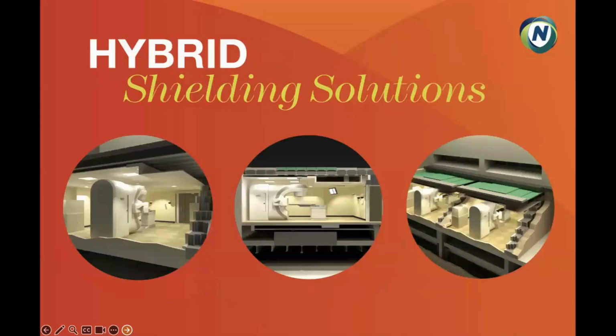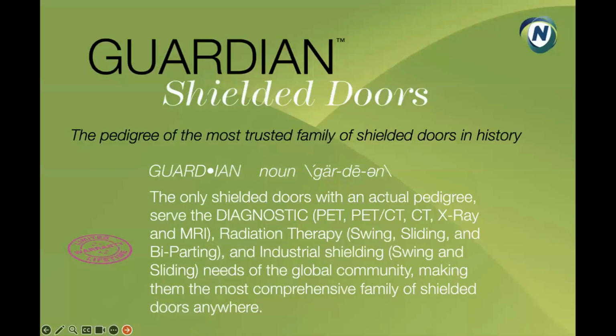And yeah, like I said, it's a hybrid solution. They will work with the dimensions that you have to shield to the physics design that you have with the most cost-effective solutions that are out there. Everyone knows that the higher density material, the more the cost increases. So if you can have a combination of normal concrete with a tiny bit of high density concrete and avoid lead completely, then great. But if you've got to flatten out your primary barrier and you need to have a straight space, then they will work with that to give you a hybrid solution of what you need to shield effectively in the space that you have.